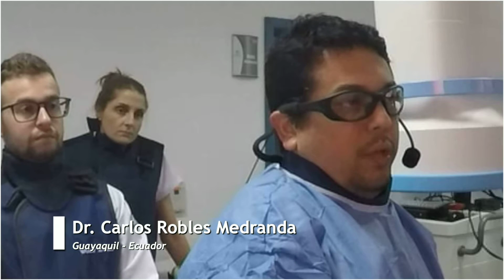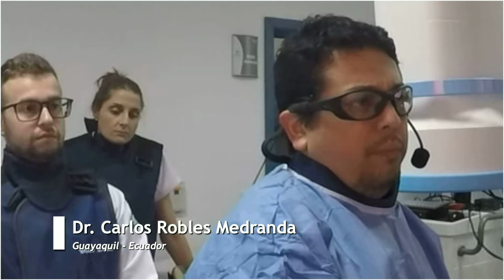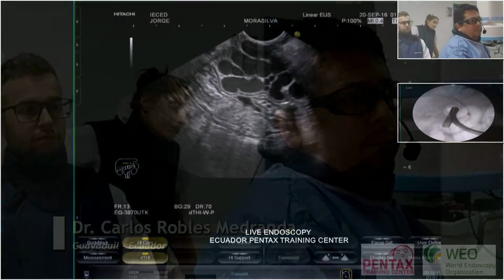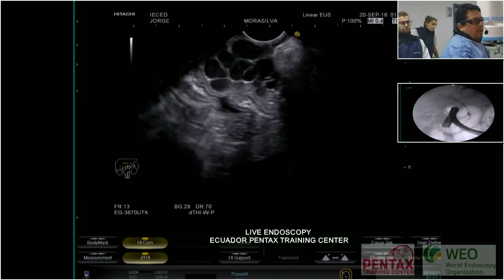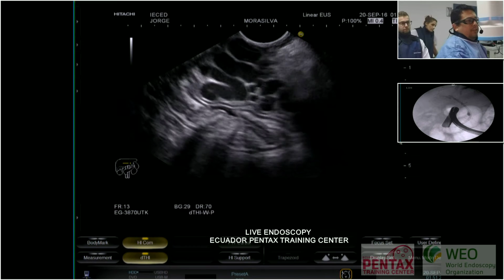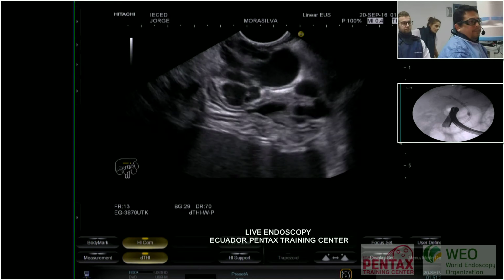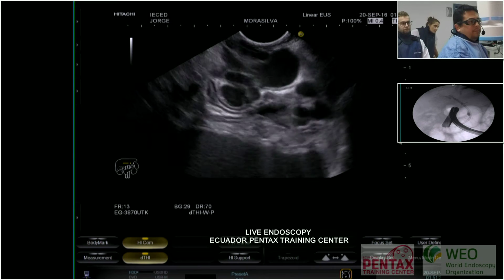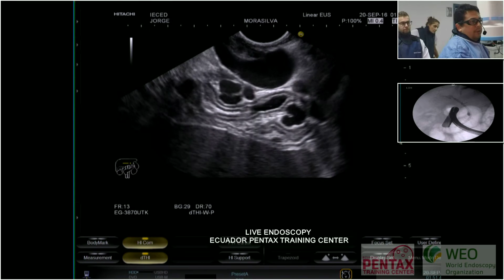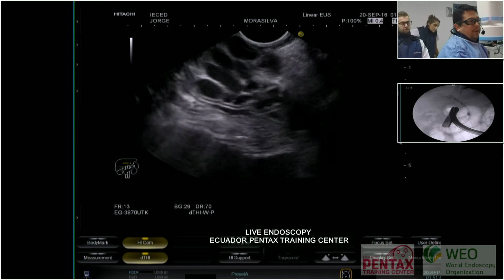Today we will present a case of a 62-year-old man with cirrhosis and portal hypertension and gastric varices. Here we will present a new technique: US-guided coil plus cyanoacrylate injection for the treatment of these gastric varices.